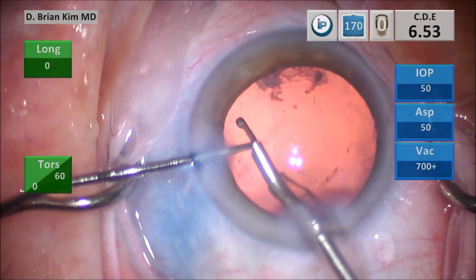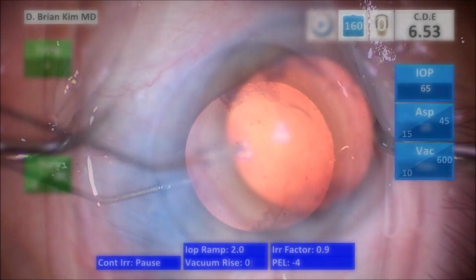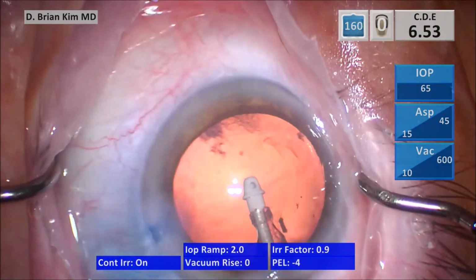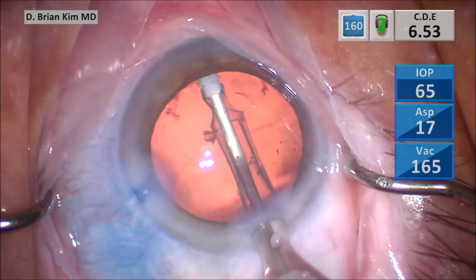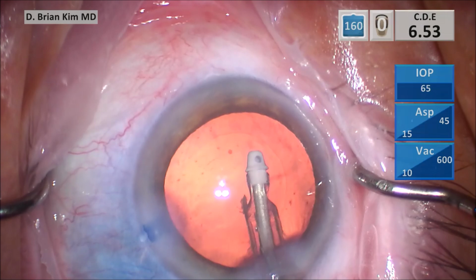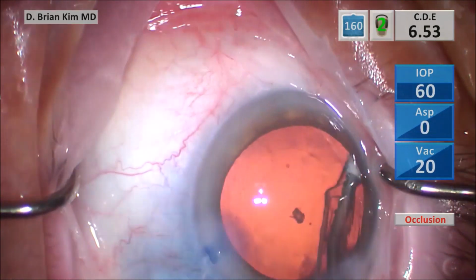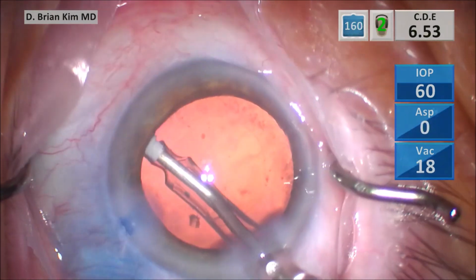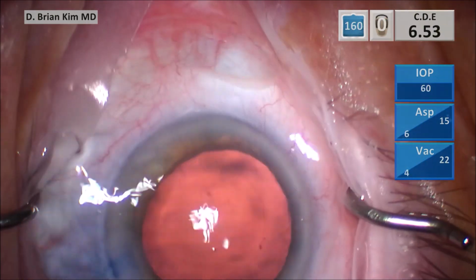So I take the chopper out, push BSS in, take the phaco tip out, and then go in with the I/A handpiece. I'm removing some of that lens material from under the rexis edge, but I quickly switched to polish mode because one, I know that there's very little cortex in this very dense lens. And whenever you have dense lenses, I do worry about the zonules.